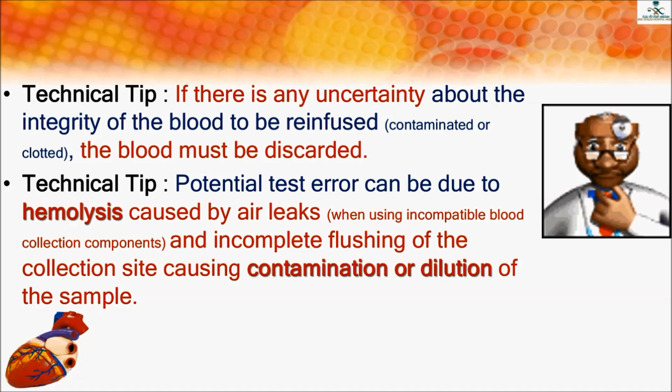If there is any uncertainty about the integrity of the blood to be reinfused, the blood must be discarded. Potential test error can be due to hemolysis caused by air leaks and incomplete flushing of the collection site causing contamination or dilution of the sample.